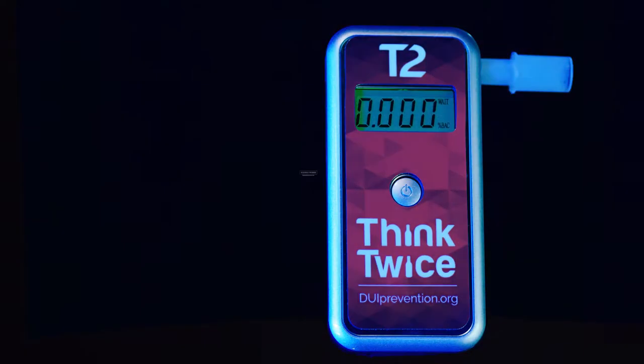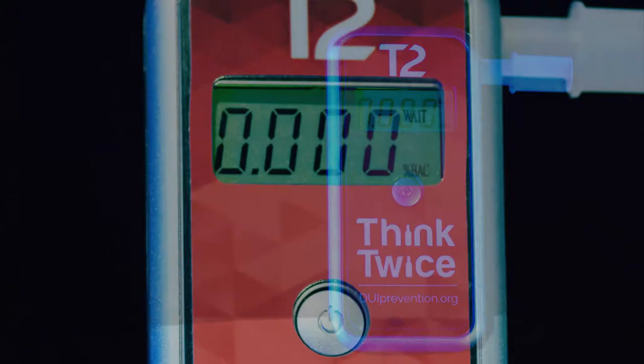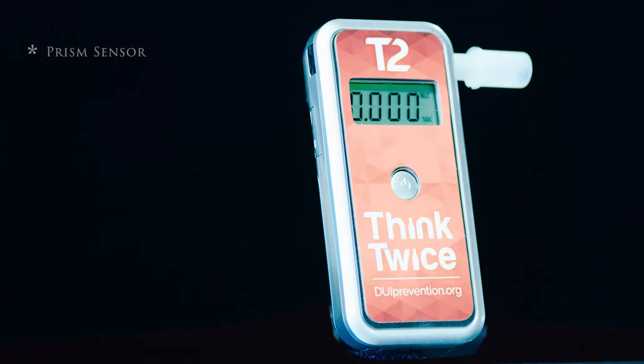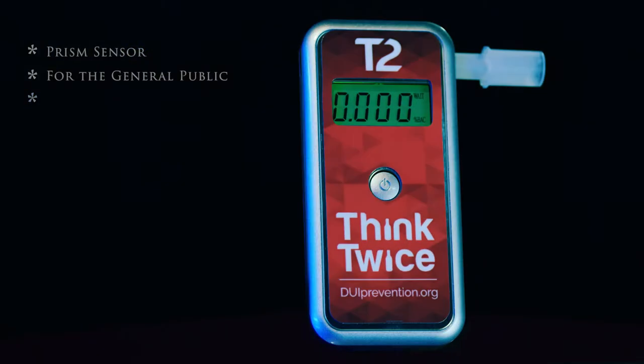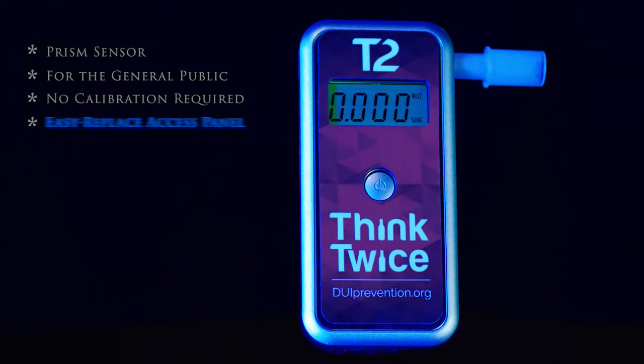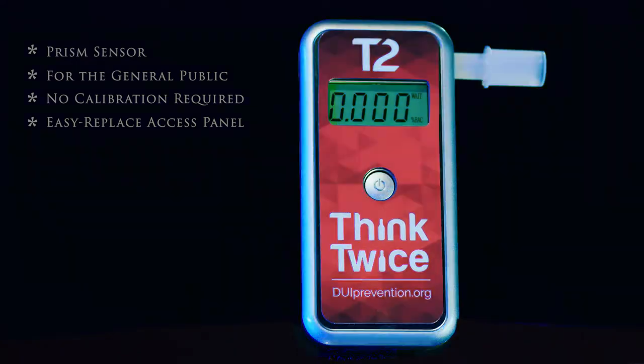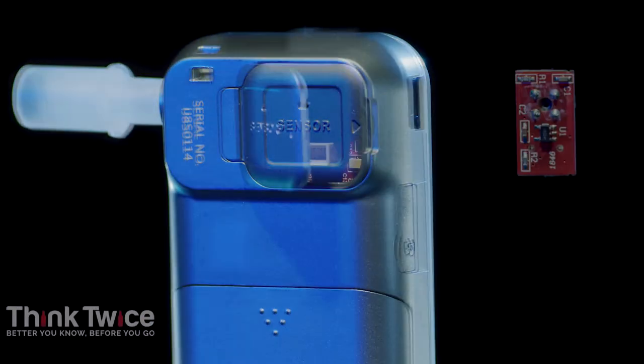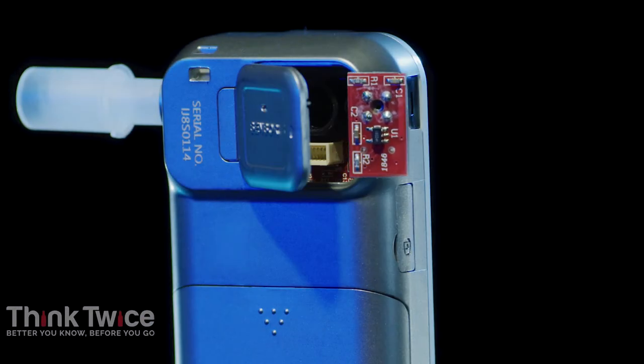Did you know a digital breathalyzer requires calibration to maintain accuracy? The Alcomate Premium combines innovation with design and eliminates the need for calibration. The Prism sensor technology allows you to restore true day one accuracy, and replacing the sensor is as easy as changing a battery.